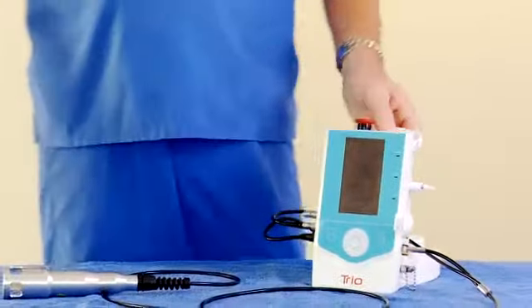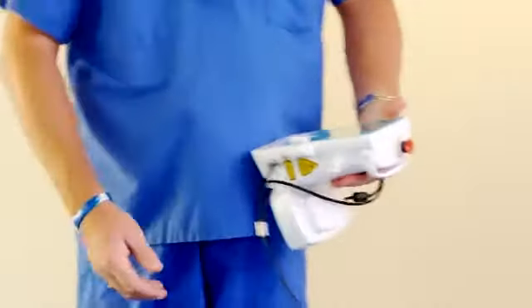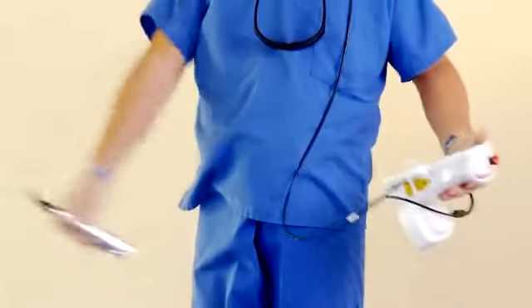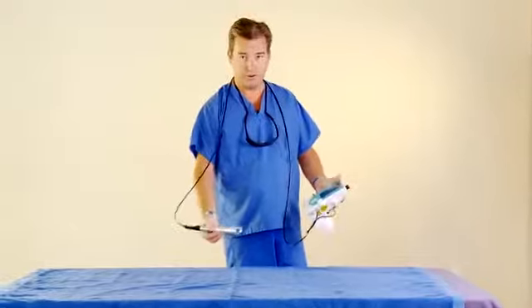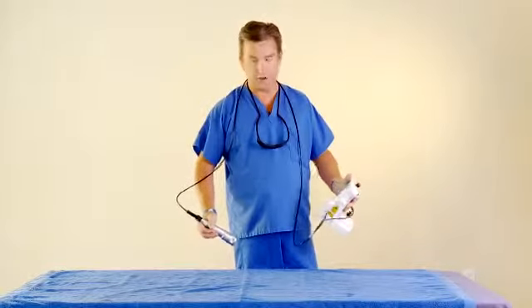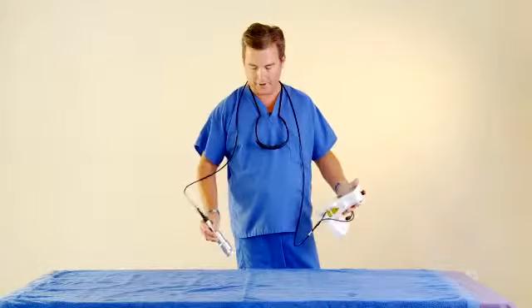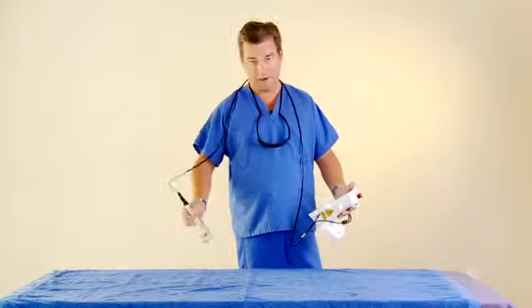For equine applications, the easiest way to treat is to have this in your left hand if you're right-handed. You can put the optic fiber around your body and you can get down to lower positions. You can get up on a back. The laser's in your hand away from the horse if they decide to kick or back up. Your laser's in hand, not on the ground. This is the easiest way, to put the cord around your neck to keep it out of the way of feet and moving hooves.